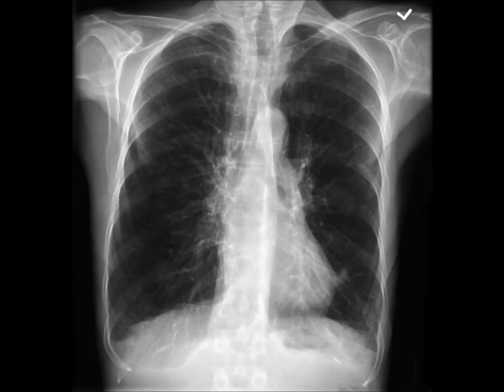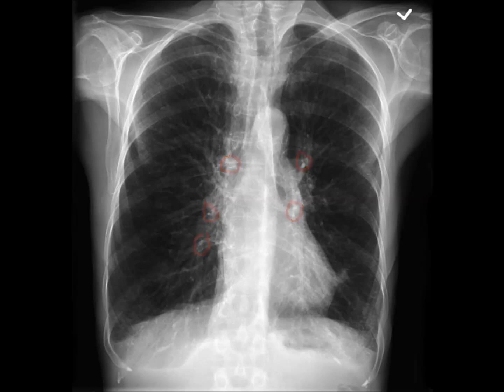Now on to the next example. The first thing to comment on is the technical quality — the patient may be rotated slightly, and it's hard to see the intervertebral spaces through the heart, suggesting underpenetration. The most striking thing to note is that the lungs are overinflated, with the eighth anterior rib intersecting the diaphragm at the mid-clavicular line. Going through our system shows flattened hemidiaphragms on both sides with blunted costophrenic angles, and you can also see some small areas of increased opacity in the hyla. The hyperinflated lungs and flattened diaphragm are characteristic of COPD.